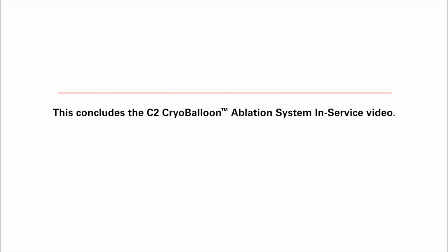This concludes the C2 CryoBalloon Ablation System in-service video.